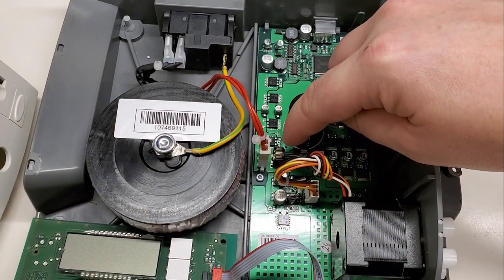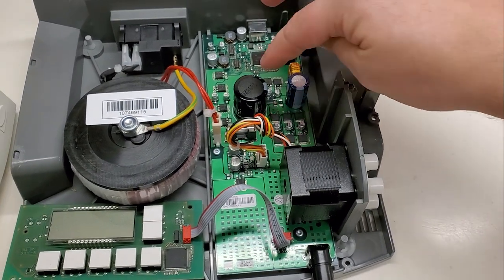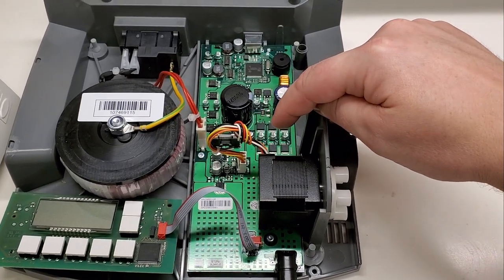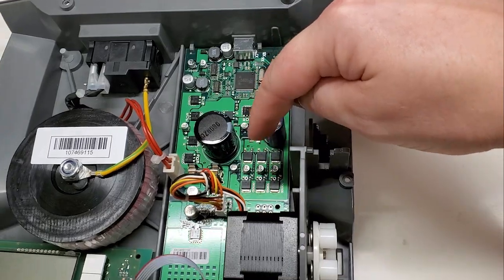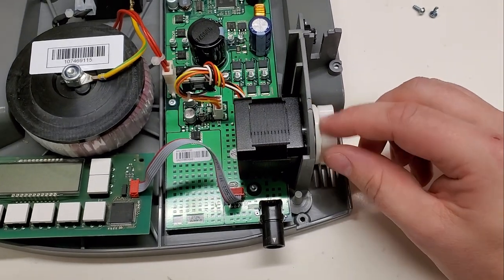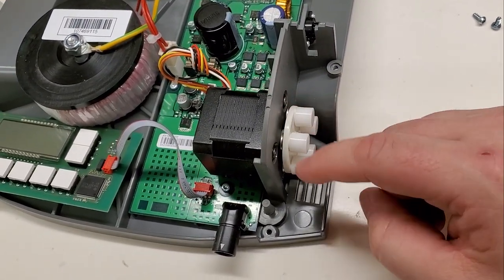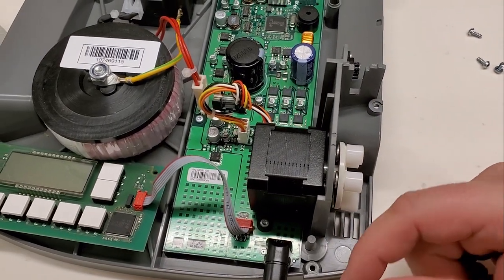If you look right next to it, you see a giant plus. So that is a DC bus, and from here your meter is going to be on DC to check and see if you have voltages. This right here is a controller chip, and over here you have your stepper motor driver, which is this group of MOSFETs, and I think, yeah, there's one over there, these ones over here, and this one over here. And they control the speed of this stepper motor. Now, the stepper motor is on a peristaltic pump. Normally, a piece of tubing comes in here, and based on the speed of this pump, that is how much irrigation you're going to have.